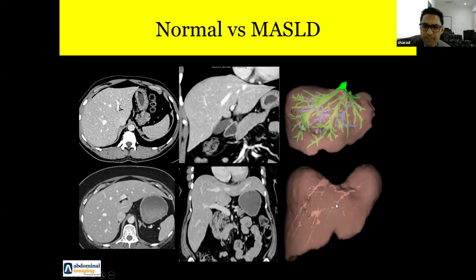So this patient is not full-blown cirrhosis, but is already going into F2, F3 fibrosis. Surface nodularity is something which happens in the end. If we only look at the nodular surfaces, the window will be lost. So it is at this stage that we have to catch things.